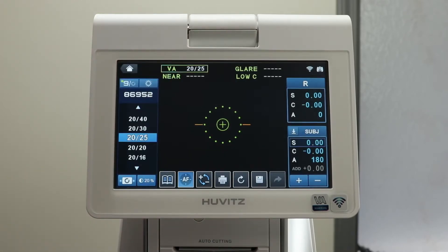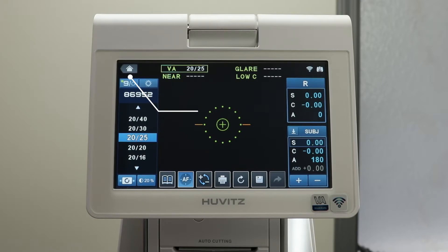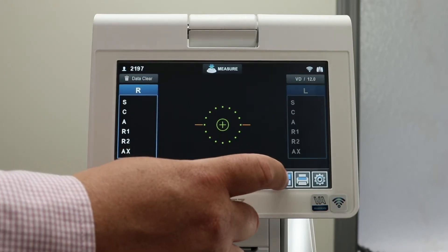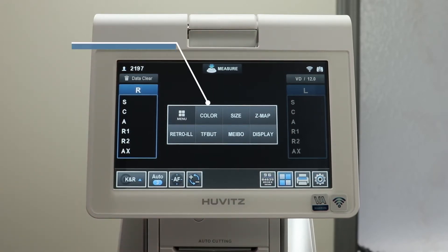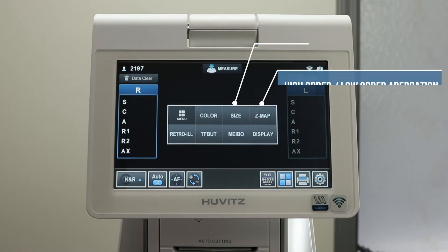The visual acuity mode will give you near, glare, and low contrast testing. In the main menu, you have color view mode, pupil size, and high order and low order aberration.